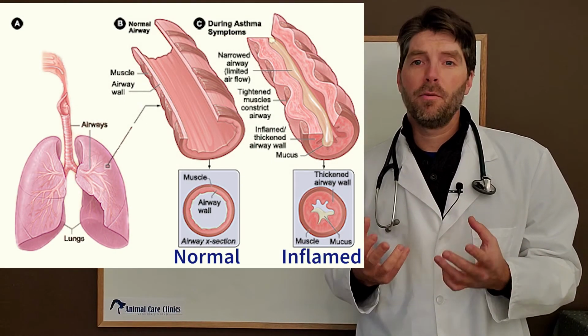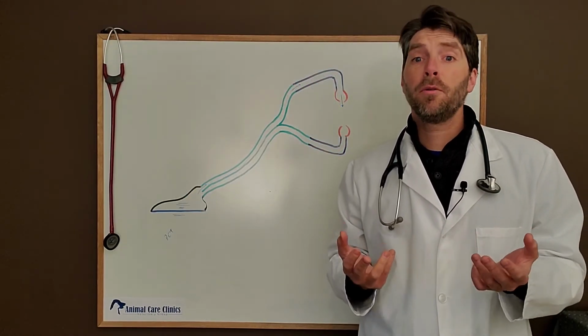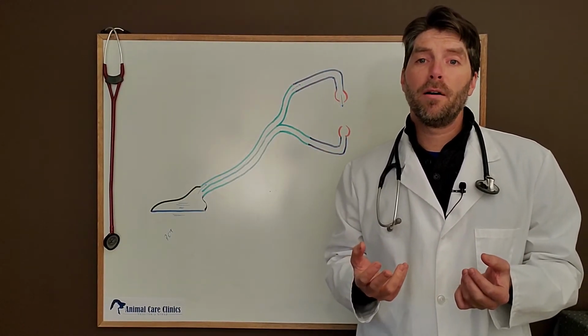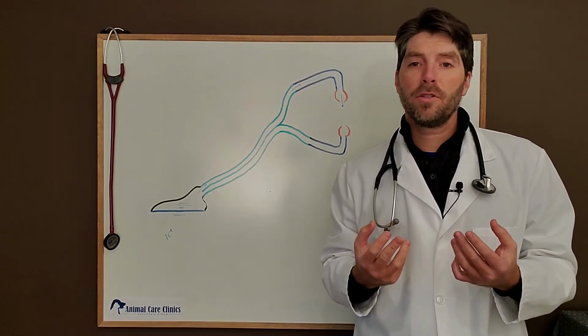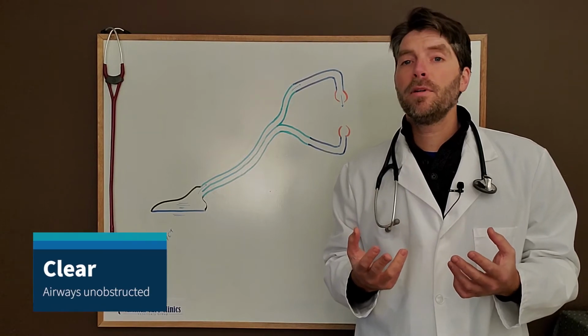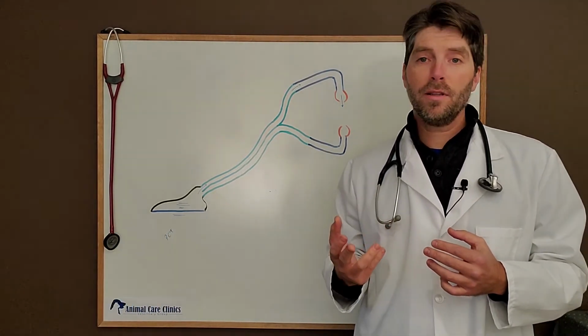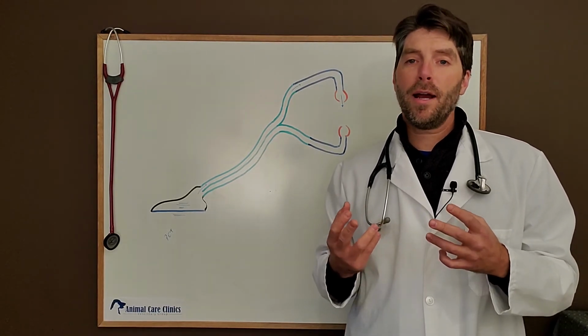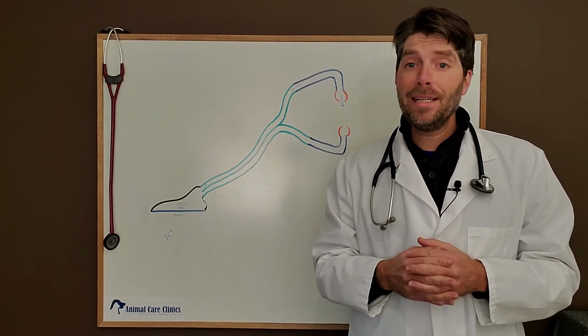And we often hear a kind of wheezing sound. If we hear that, we know to look a little deeper to see what's going on. The other thing that we listen for is to make sure the lung sounds are clear. And by clear, we mean we don't want to hear other sounds in the lungs. We don't want to hear fluid in the lungs, and that can be heard as crackles or gurgling. And we want to be sure we can actually hear lung sounds.